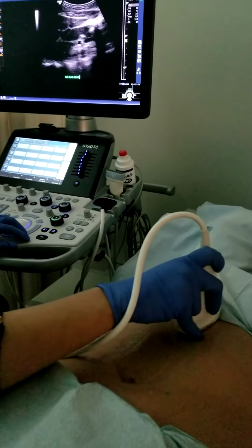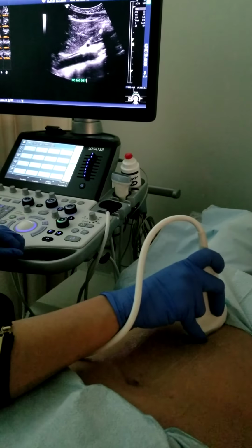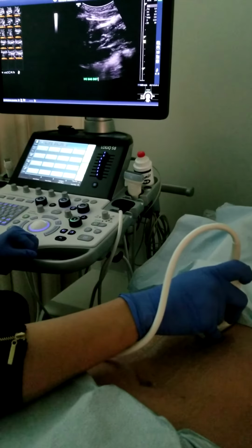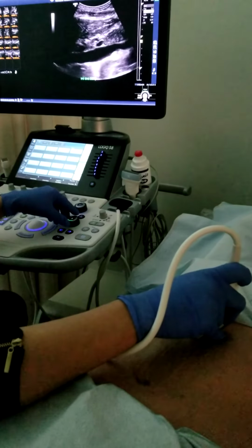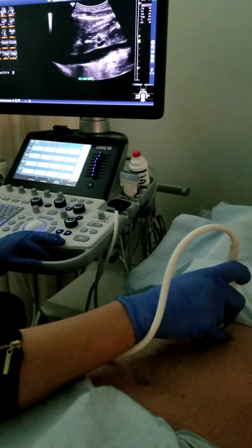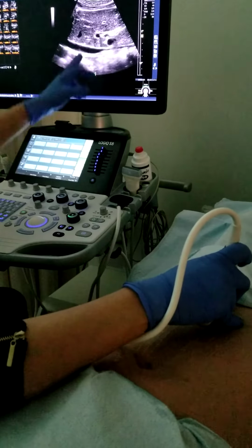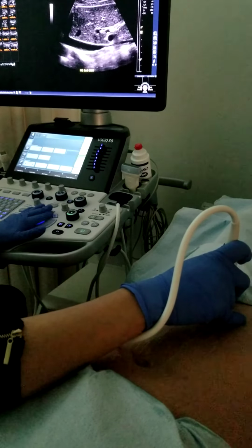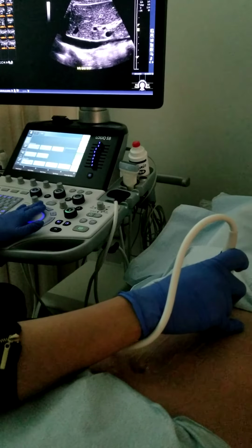So I'm going to start over. Indicator towards my patient's head. I'm starting at the xiphoid process. I'm going to find my liver. I'm going to find my aorta, and if I know that my IVC lies to the right of the aorta, then I'm going to swing my probe towards the right of midline, and there is my IVC. Can you take a breath in, please, and hold it? Remember, taking a breath in is going to compress that vein a bit. But actually, go ahead and breathe. So I waited for it to open up, and there it is.